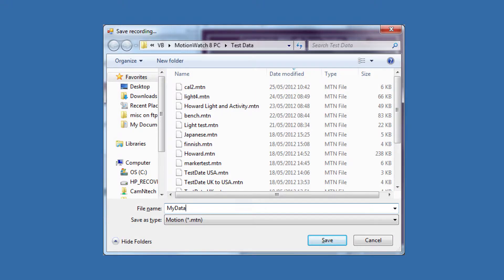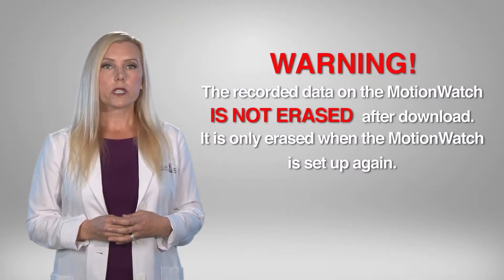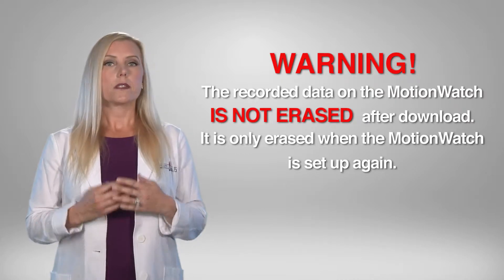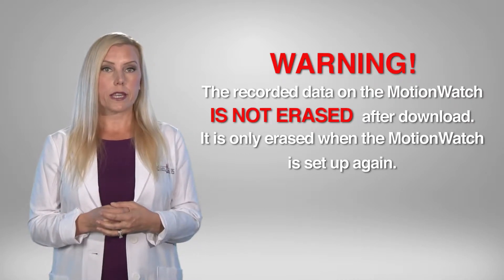When all the data has downloaded — a completely full memory will take less than a minute — the Save Recording dialog will open to allow the data to be saved. Remember that the recorded data in the MotionWatch is not erased after download; it is only erased when the watch is set up again.